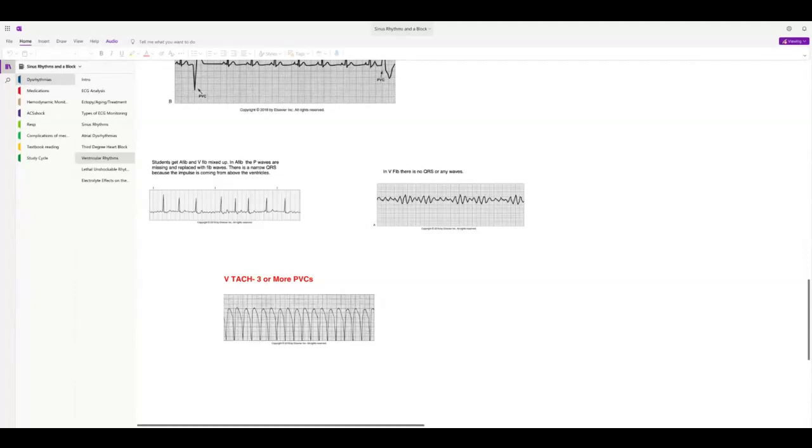If the piece that actually goes on the IV pole, actually I'm looking at it now, the valve, is lower on the IV pole and your patient is not level at the A line, meaning right there at the heart, then the numbers are going to be off. So you have to make sure that they're all level.